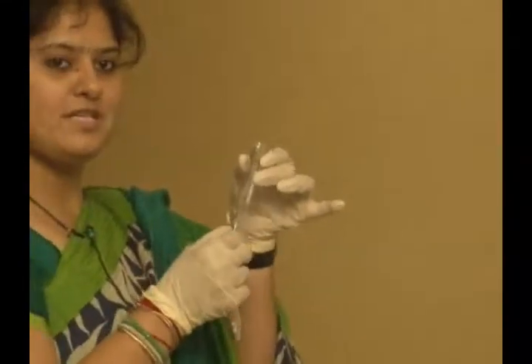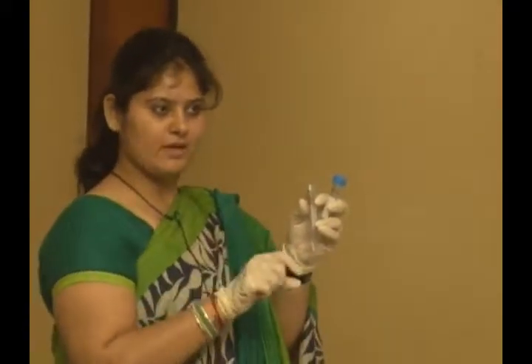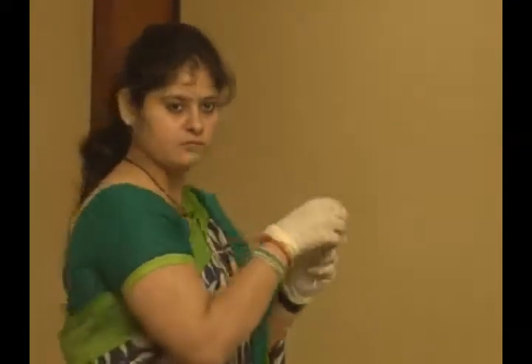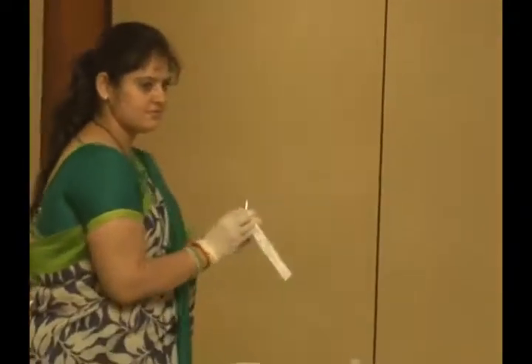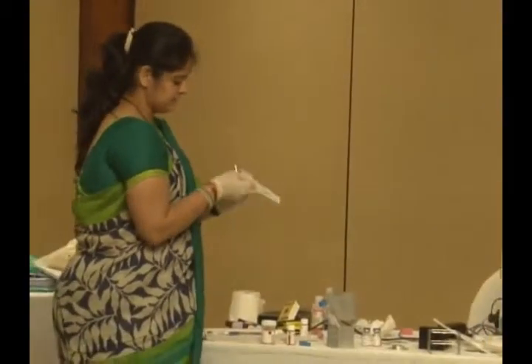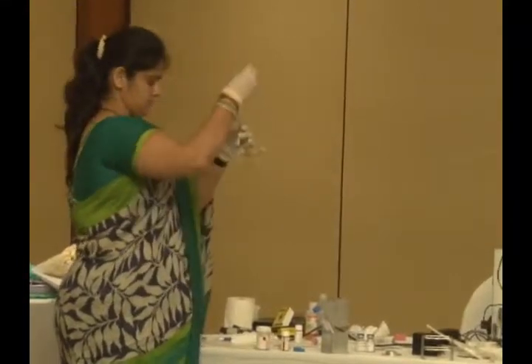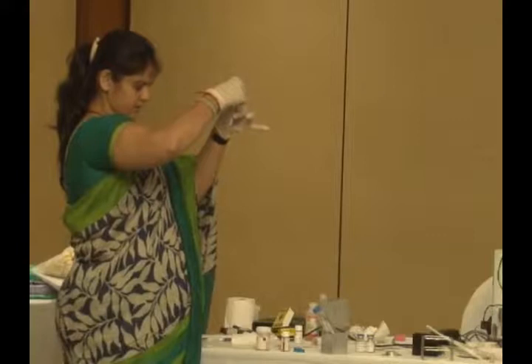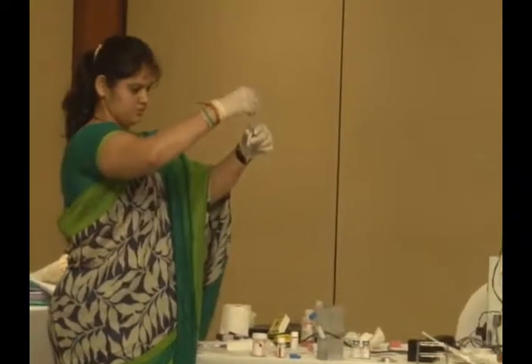Now transfer this pellet to another tube, because this tube is contaminated. So when you add medium in the same tube, all the contamination will come below and will get mixed with the pellet. New pipette. Take the pellet, transfer it in the new tube.